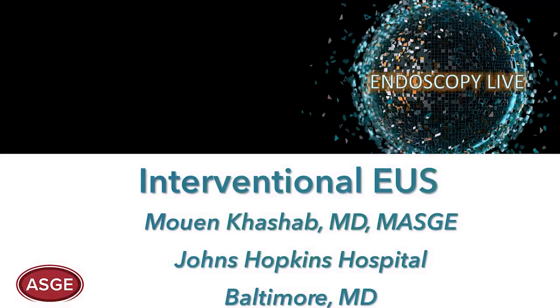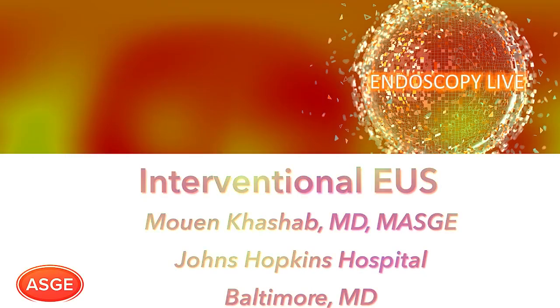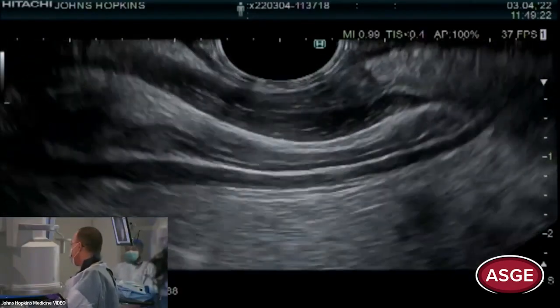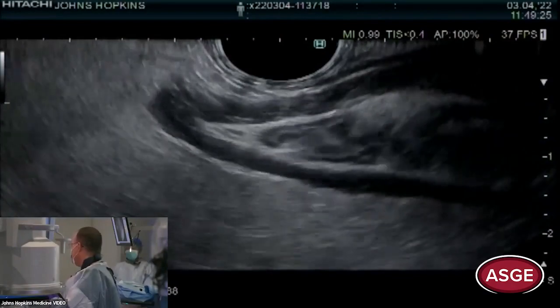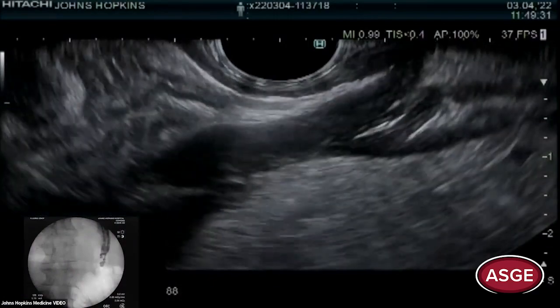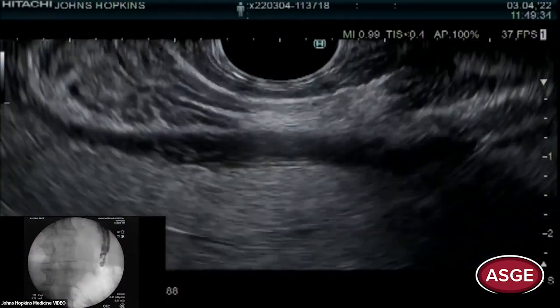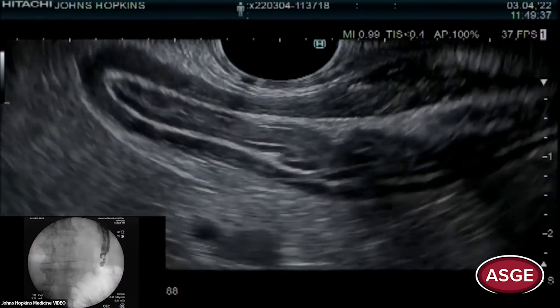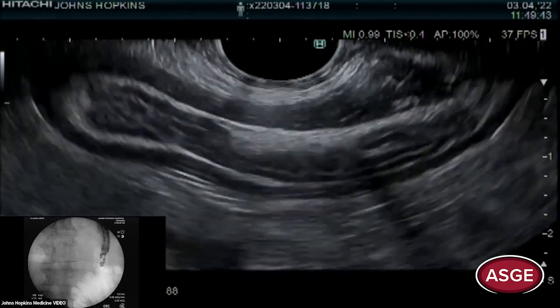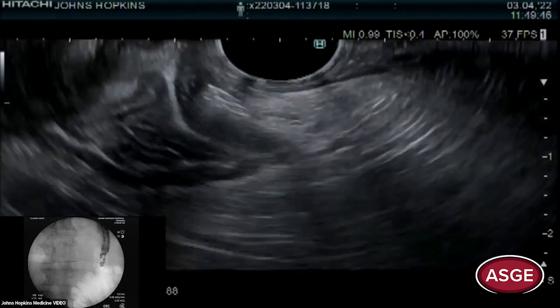Dr. Irani was going to show a case but is having technical issues, so we're going to start an EDGE here and switch to him if resolved. This is a middle-aged gentleman who came in with cholangitis. He has Roux-en-Y gastric bypass anatomy and a 1.3 centimeter stone in his duct. The plan is to do EUS-directed transgastric ERCP. In my practice, I go straight to EDGE instead of enteroscopy ERCP or lap-assisted ERCP.